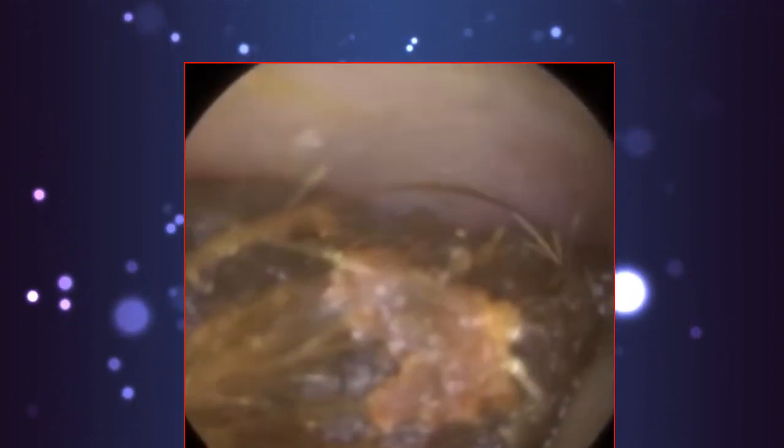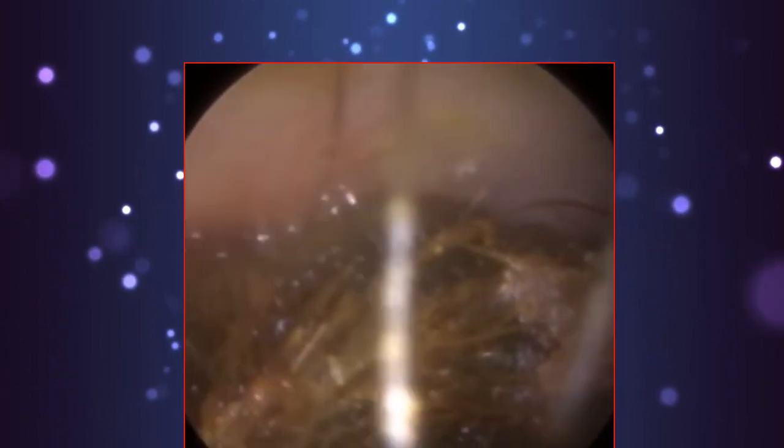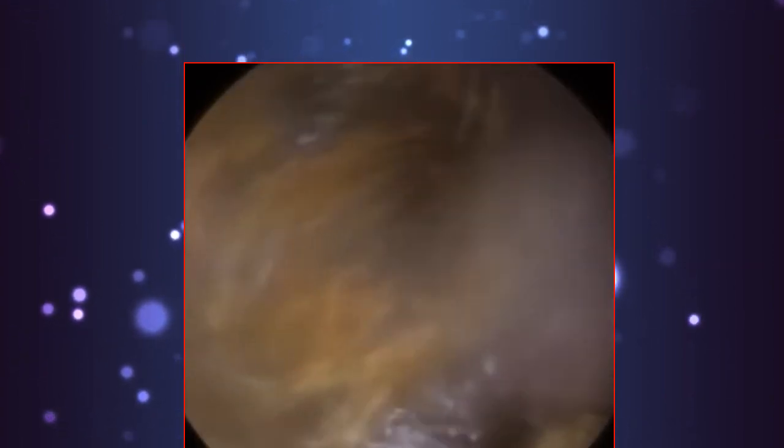And once more, it doesn't help when you've got all these hairs in the ear. It really does reduce the suction grip. And if you look at the top part of the ear canal there, you can see just the valley shape. You can see just how it narrows. It's almost like a roof, the top of the ear canal. So I'm actually targeting the top of the ear canal now. There's a few hairs that are slightly in the way, but it's not really affecting me trying to work away at this wax.